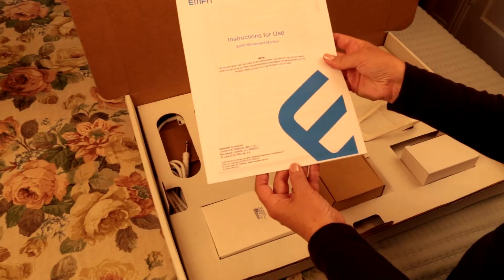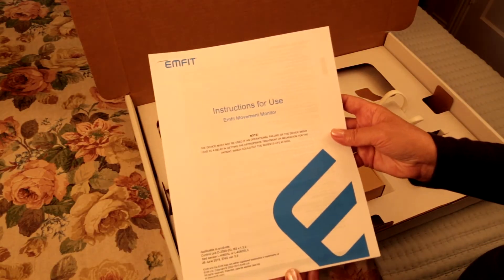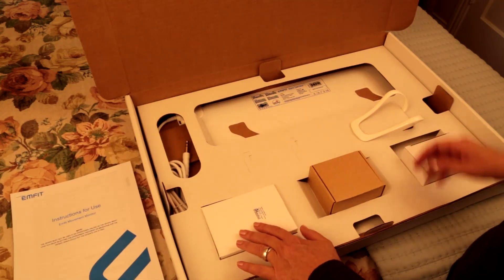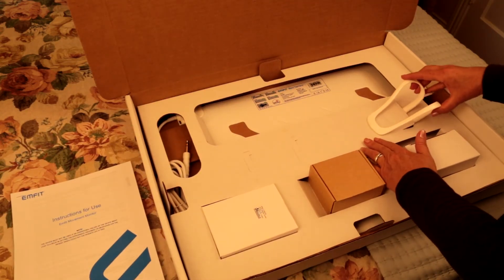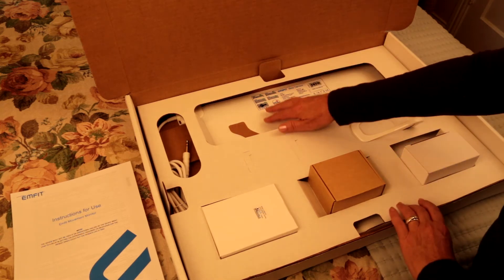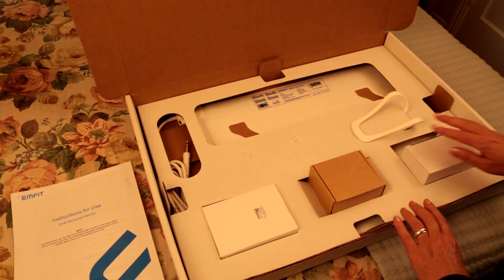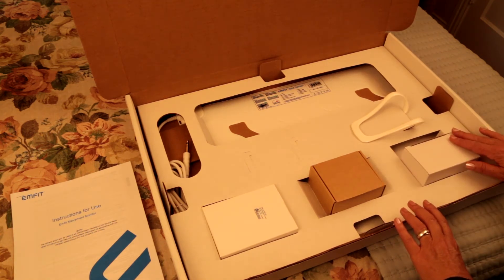The contents of the box will include the Mfit manual, the Mfit control unit, a bed clip for mounting on the headboard, and the patented Mfit bed sensor. You may also have ordered one or both of the optional accessories, which include the remote alarm and the medical grade AC adapter.